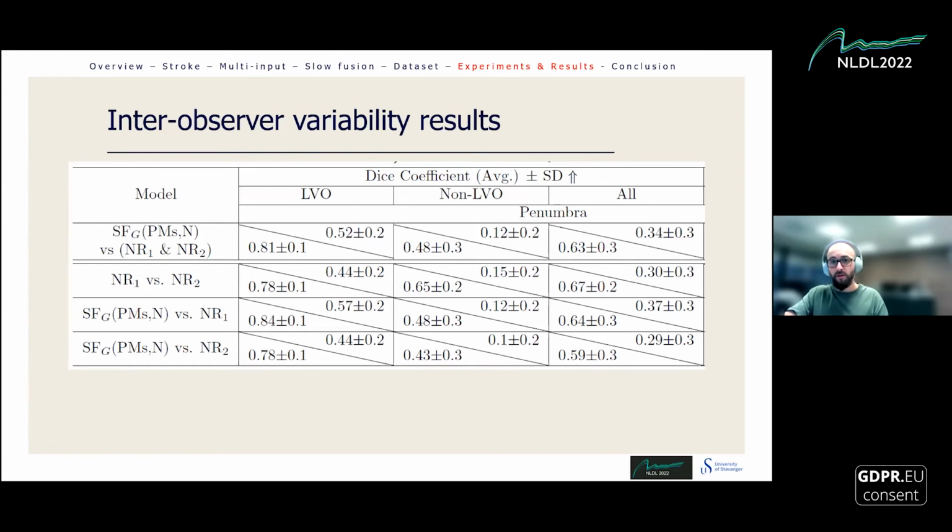I forgot to mention that all the results that you have seen in the table are based on our validation set, because in order to choose the best model, we don't want to use the test set, as that is secret and kept separate. So we use the validation set to select the best model, and then use the test set to see how good our prediction is. Here are the results for the test set only.